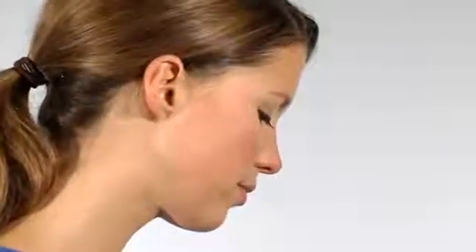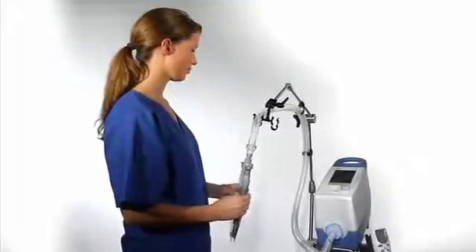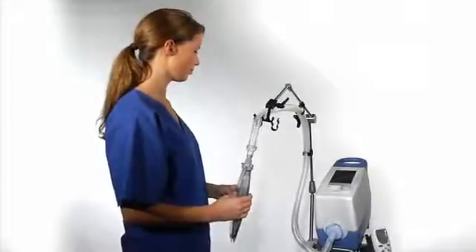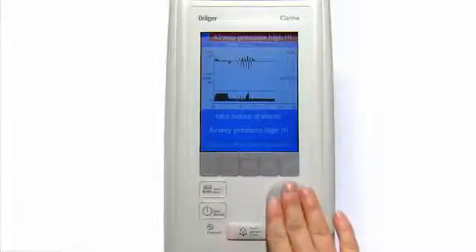Please compress the test lung several times during the upper pressure level. After a few seconds of compressions, you will hear an alarm signal and the message airway pressure high will appear. Please confirm the alarm by using the rotary knob.